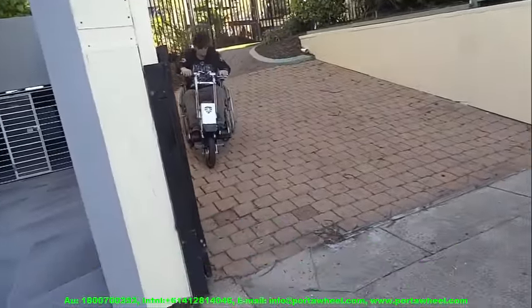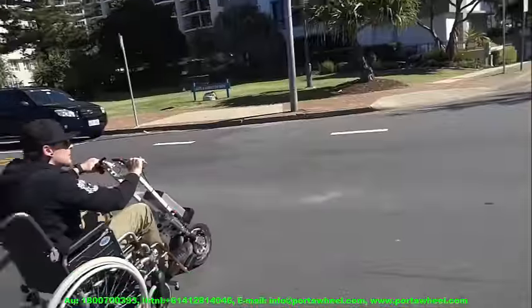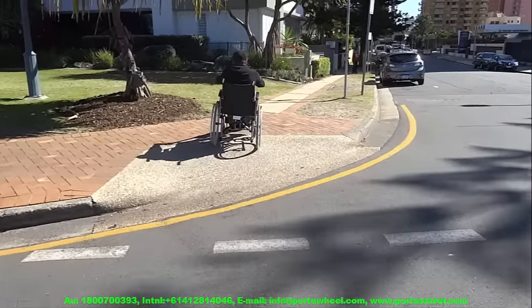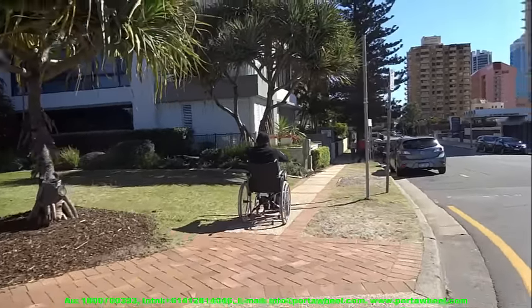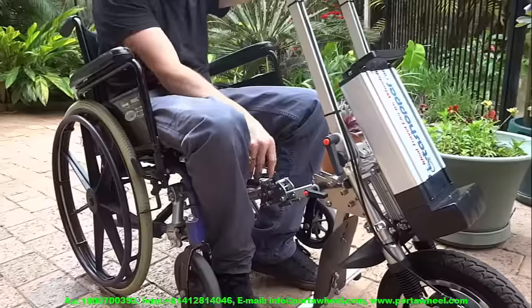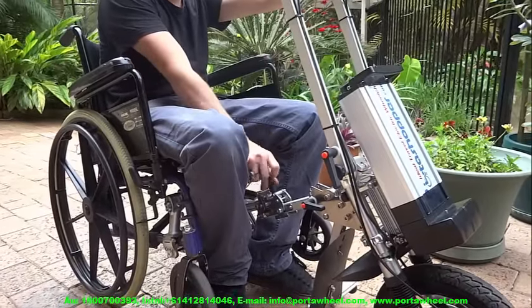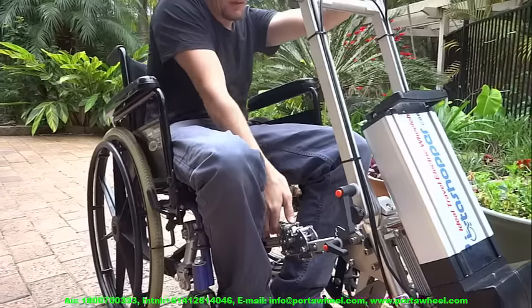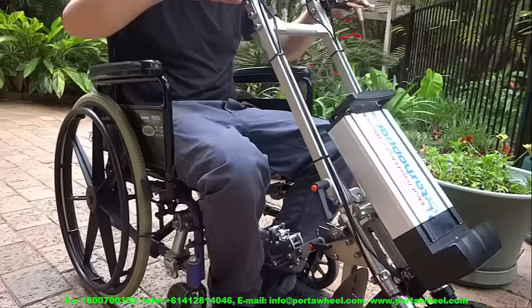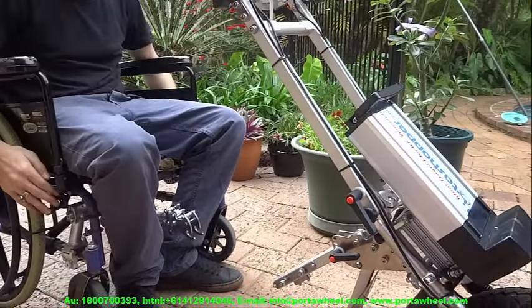One of the most important benefits of the PortaWheel is its ability to cope with just about anything your wheelchair can handle. Its front-wheel-drive pulling mode lets it clear obstacles up to 10cm high and climb inclines of up to 20 degrees. With adjustable front caster clearance, there is virtually no street gutter or ramp too steep for it, making it ideal for commuting around cities, tourist attractions with cobblestone streets, or third-world environments. It is ideal for travelling.